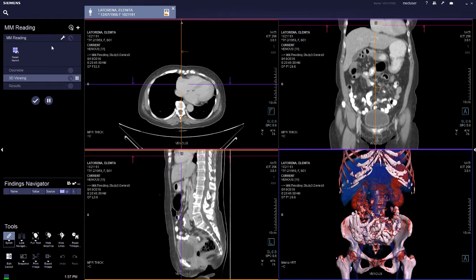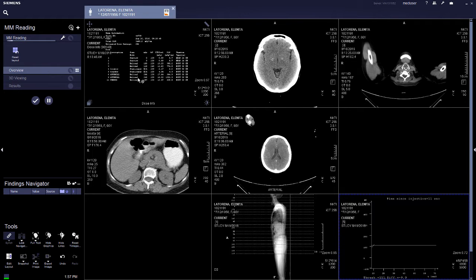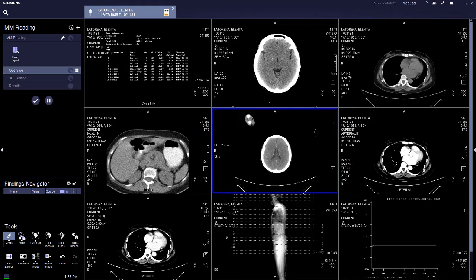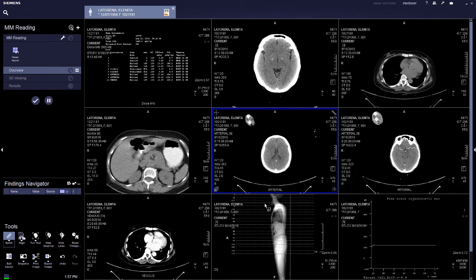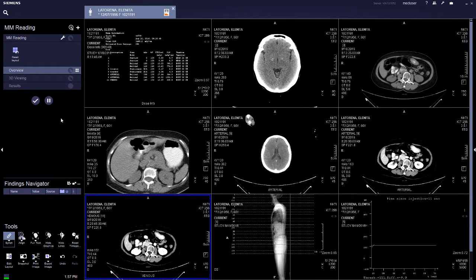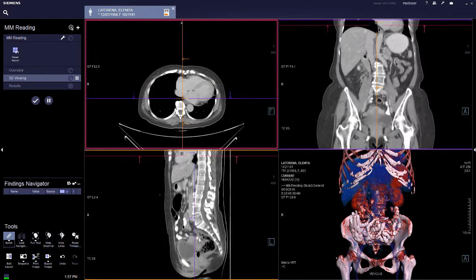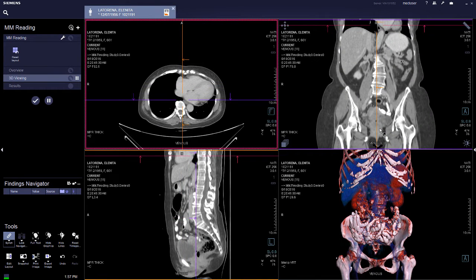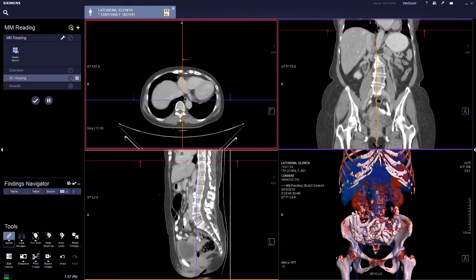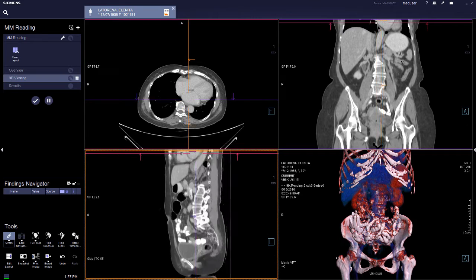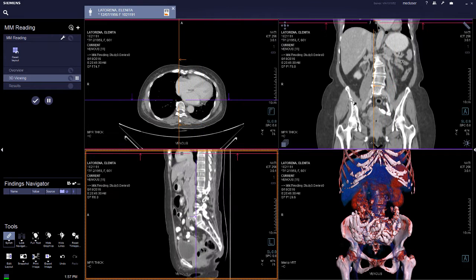The MN reading has three workflow steps. The first is the overview, which gives a general overview of all the series available in the patient folder. The second is 3D viewing, for MPRs and VRTs — this is where you can visualize the series and perform image manipulations.